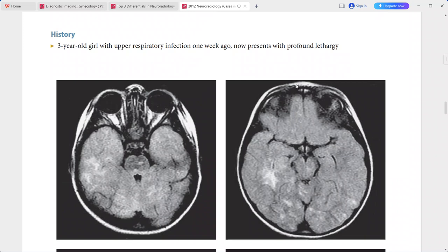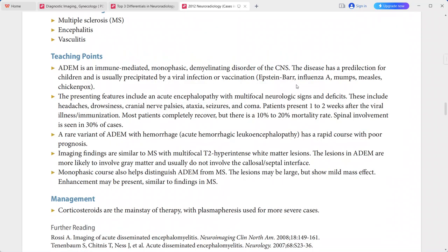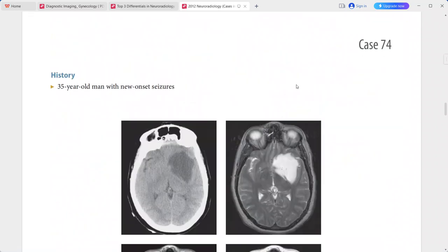This is a typical case of ADEM. In the differentials, you can include multiple sclerosis, encephalitis, and vasculitis.